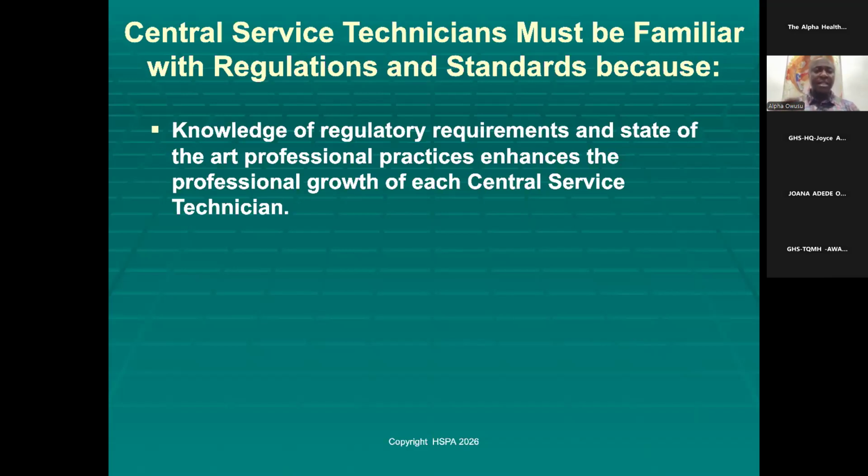I have to test how air is being taken from the machine, how steam gets into it, how to inspect. All these regulations are there. If he or she has knowledge about it, it will reduce infection and the department will have a benchmark. The department will run in a way that we will reduce infection.